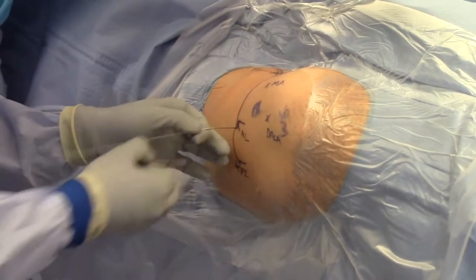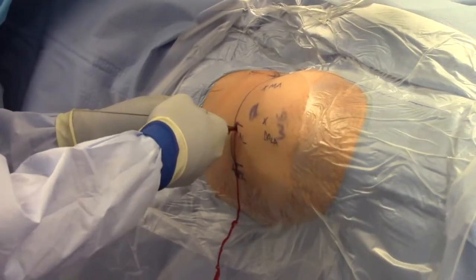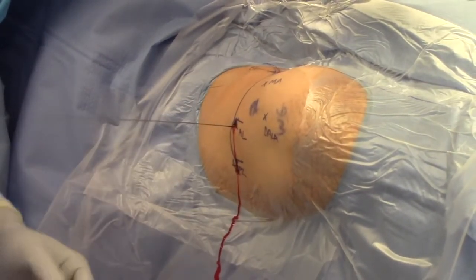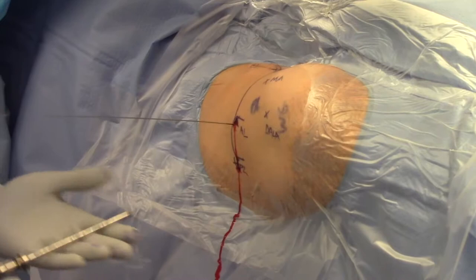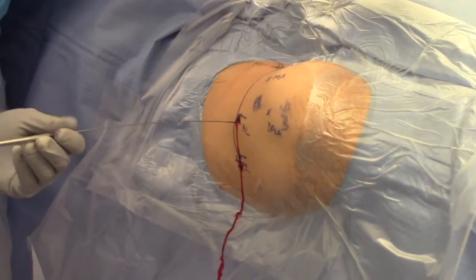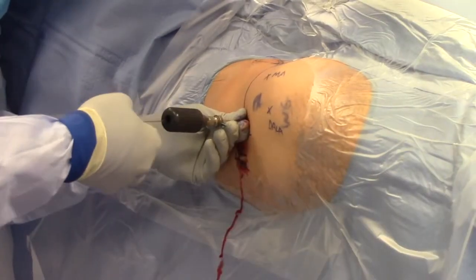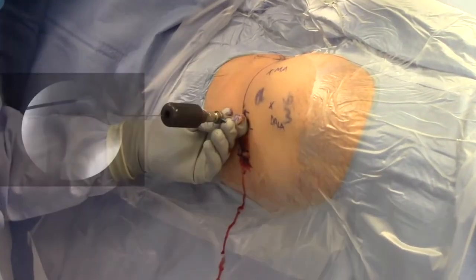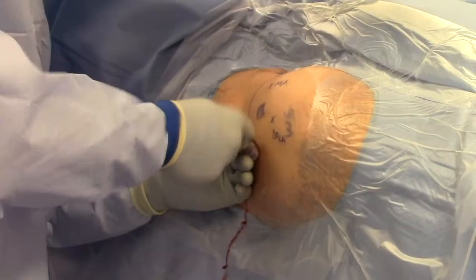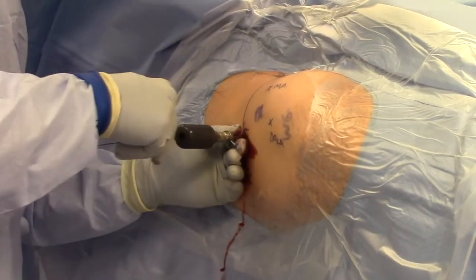The skin is incised. Once you incise the skin, ensure there are no skin bridges by placing a hemostat clamp around the nitinol wire. This is a metal cannula, 5.0 millimeters in diameter. Place this over the guide wire, but ensure the guide wire glides easily within the cannula to ensure you're not kinking it or causing any problems.